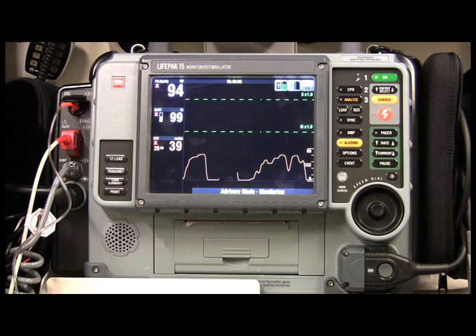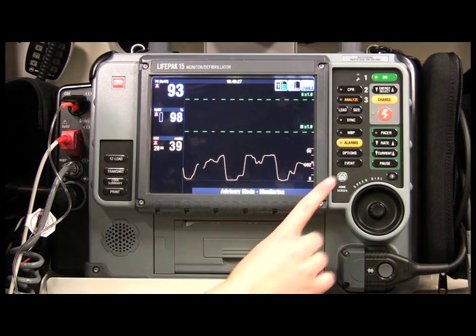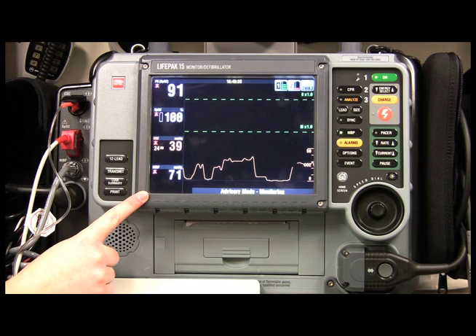Now I can go back to the home screen and we can see the waveform. It's going to look a little off because I'm talking. To take a blood pressure, go up to NIBP and it'll start to inflate the cuff.